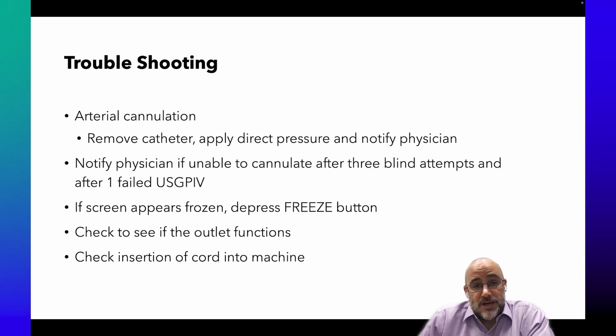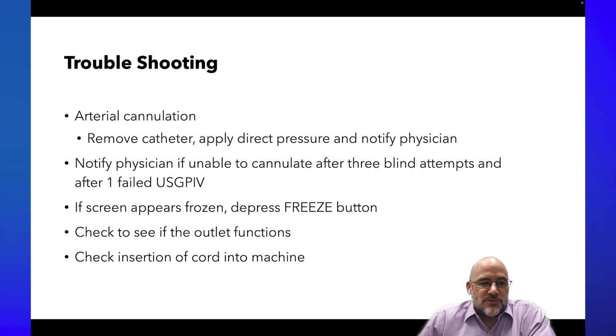So if you do manage to hit an artery, first check to make sure that no one needs an A-line. A little bit of a joke there, but what you really want to do is remove the catheter, apply direct pressure, and then notify the person responsible if needed. You're usually going to want to hold pressure for a couple minutes. I had an attending who told me that the amount of time you hold pressure is about 2 minutes after you think you're done holding pressure. That's how long you hold pressure for.